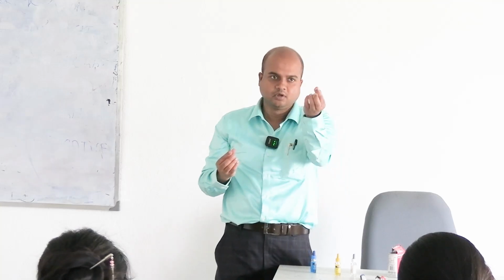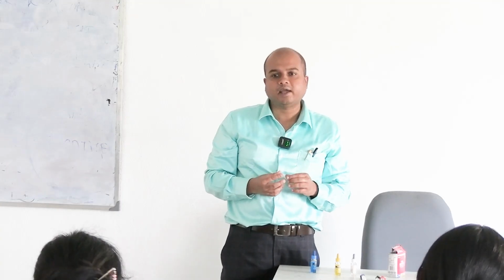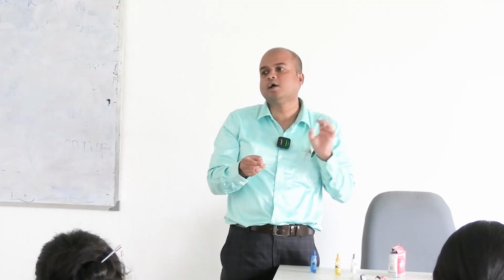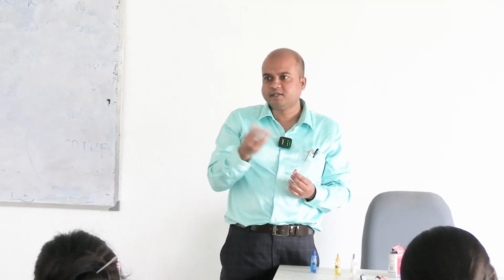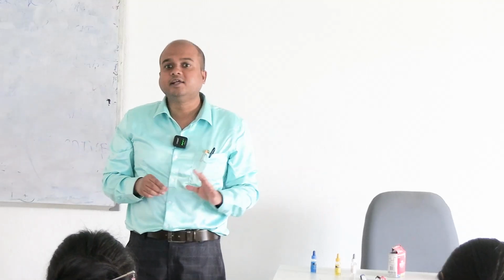We take a small drop of antisera and a small drop of blood, which we get by pricking our own finger if we take capillary blood. I add the blood to the antisera and mix it, and after waiting 10 minutes, an agglutination reaction will occur if the corresponding antigen is present.